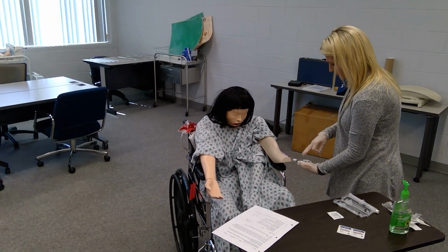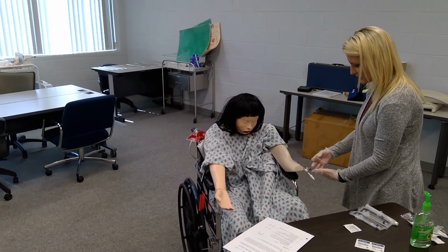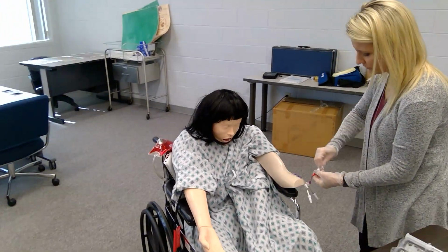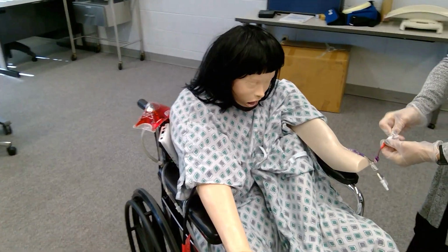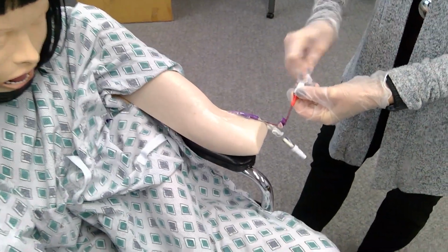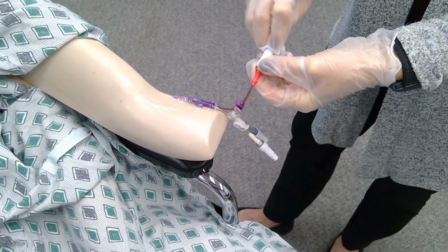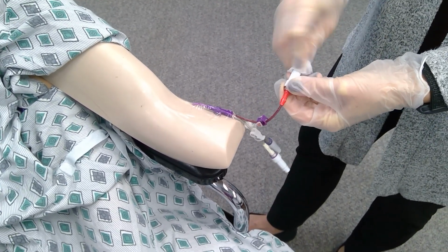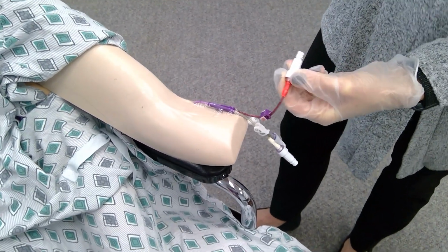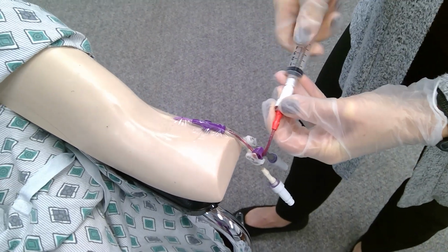Okay. Your PICC line has 3 lumens. Typically, the red lumen is designated for blood draws. So I'm going to scrub the hub for a good 15 to 20 seconds. I'm going to attach my first syringe. This is going to be the waste.